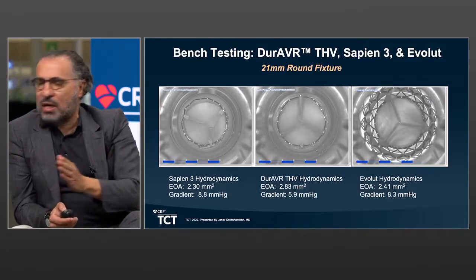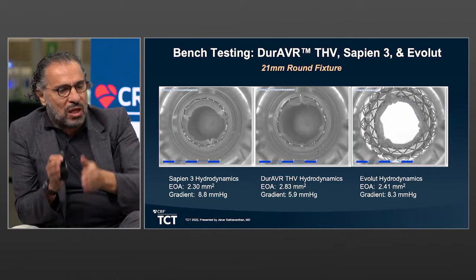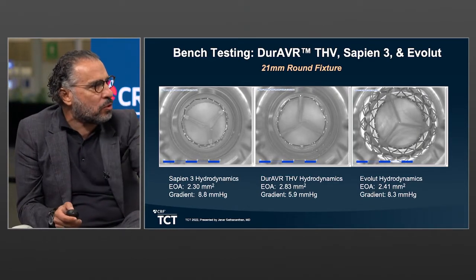small annuli. In women, where we know again that, as I've said before, the surgical techniques are a bit more challenging. I mean, having a TAVR, which can be done under local anesthesia, is a chance for any patient here. But what is important is that we should not sacrifice for the sake of the results today, the chances of tomorrow.